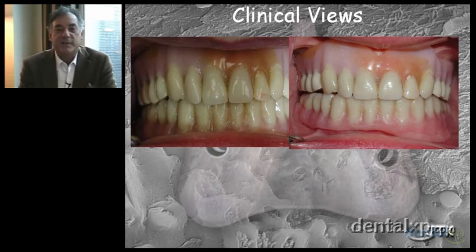While we utilize the concept of teeth in an hour, we shouldn't forget that there's a lot of preclinical aspects that are traditional that must go into the planning and the pre-prosthetic phase of the case. For example, in this view, a patient is having a denture conversion. The contours must be made ideal by our restorative teammate. The fit must be ideal.